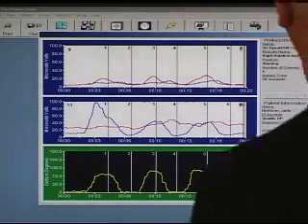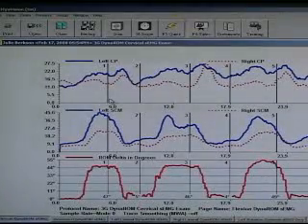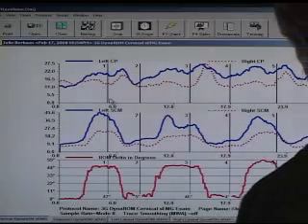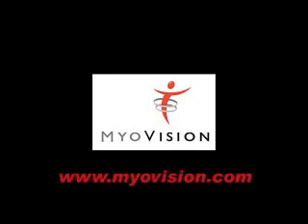Now hit review, and you'll note that it'll actually turn off the device itself. All the devices will be turned off by clicking review, and you can see the results on the screen. The tabs at the bottom half of the screen will allow you to go from screen to screen to review.